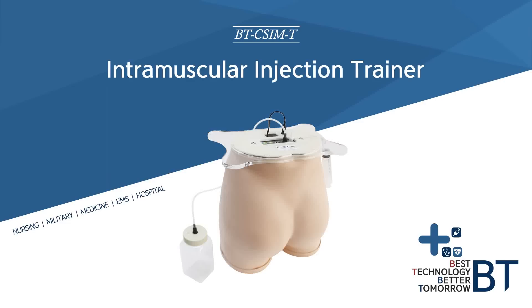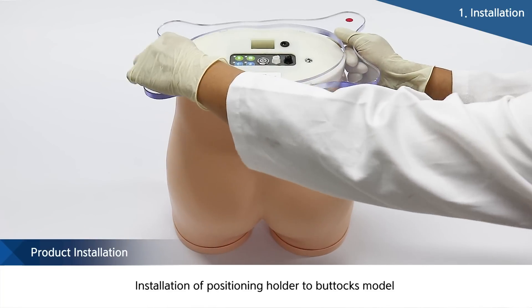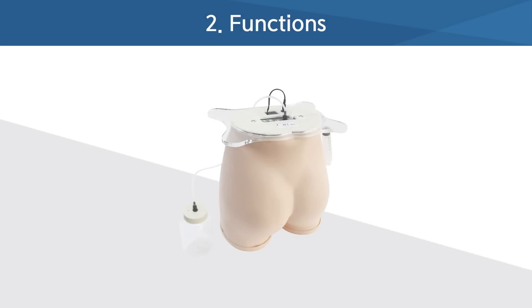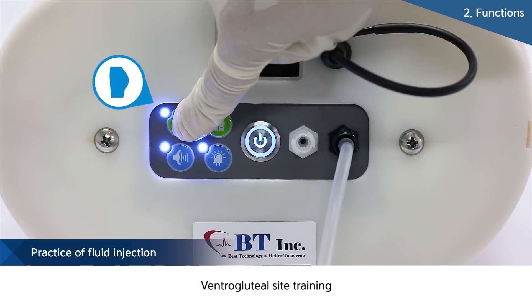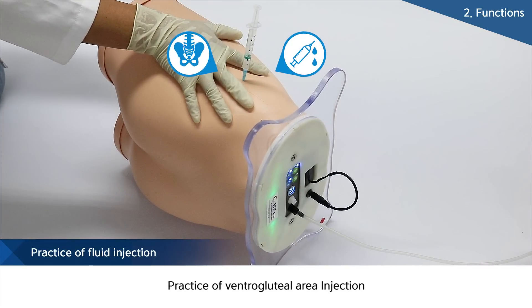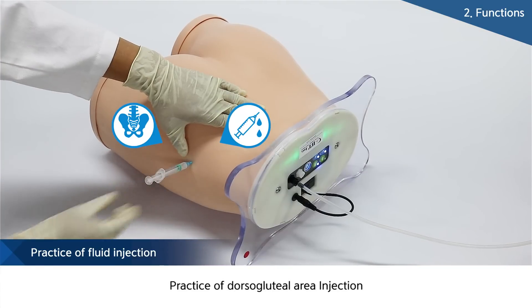I am going to explain about the Intramuscular Injection Trainer. This is a simple buttocks model for intramuscular injection education. There are two kinds of injection education: for the ventragluteal site and the dorogluteal site. The mode can be chosen by pressing the button on the upper part of the product.